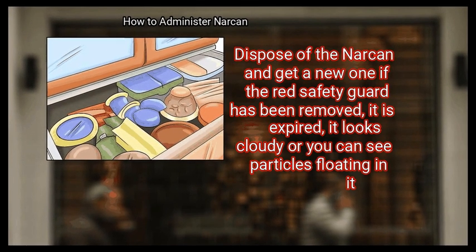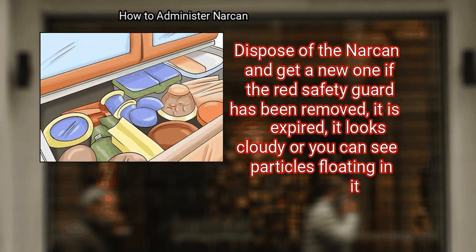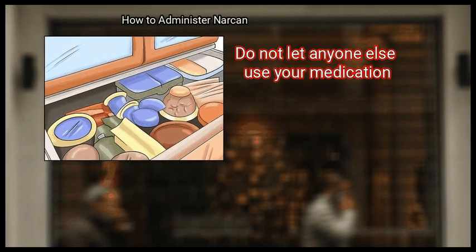Dispose of the Narcan and get a new one if the red safety guard has been removed, it is expired, or it looks cloudy or you can see particles floating in it. Keep it safely out of reach of children. Do not let anyone else use your medication.